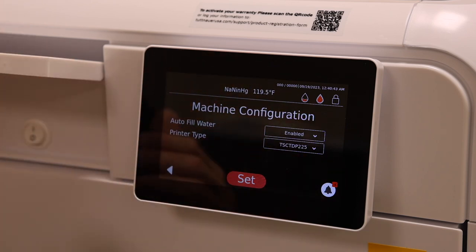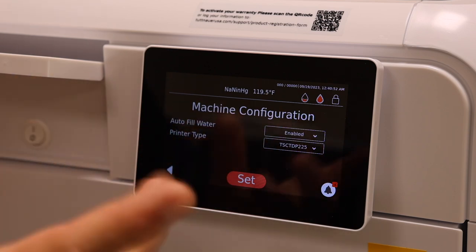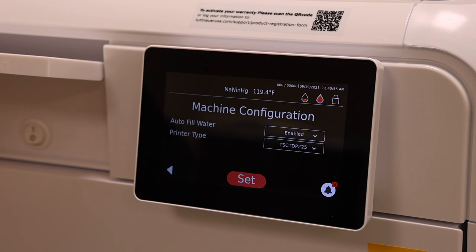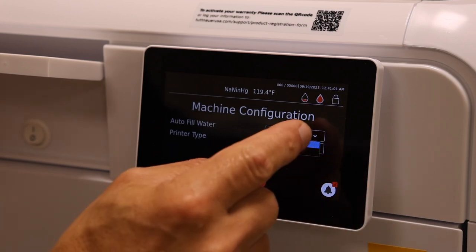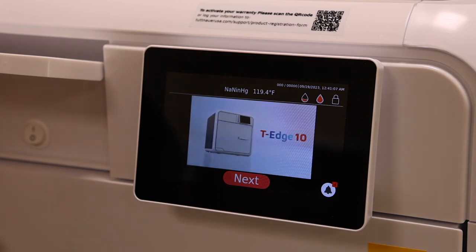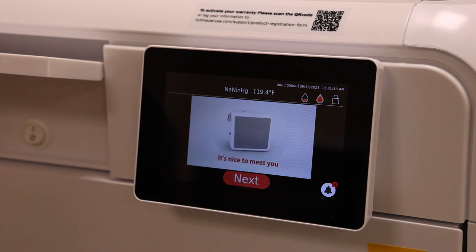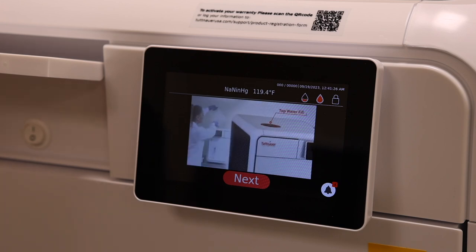This next portion covers auto-fill water and printer connections. Auto-fill allows you to connect an RO water system to the machine so you never have to buy bottled water manually. You can enable or disable this option. We'll leave it enabled and confirm. The machine will then play a brief tutorial video showing you daily, weekly, monthly, and quarterly care, and how to access the menu to run cycles.